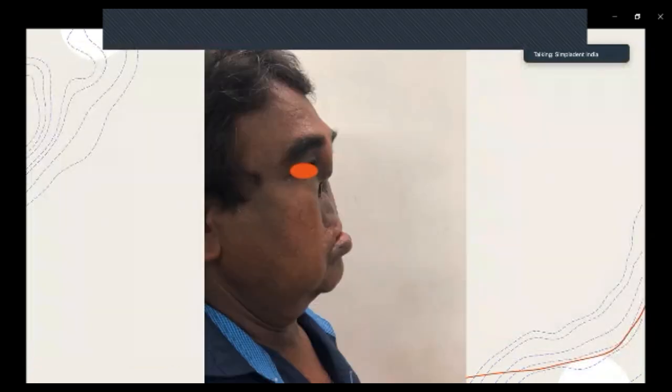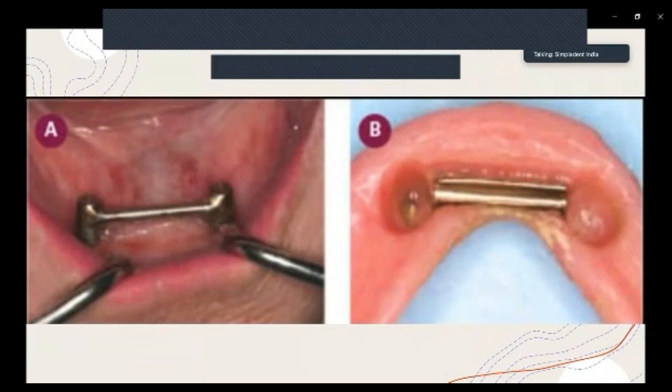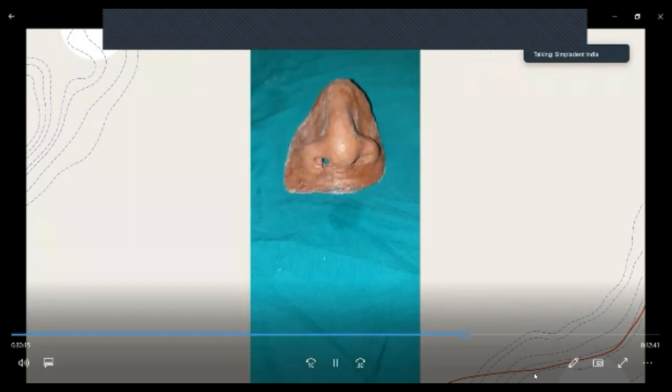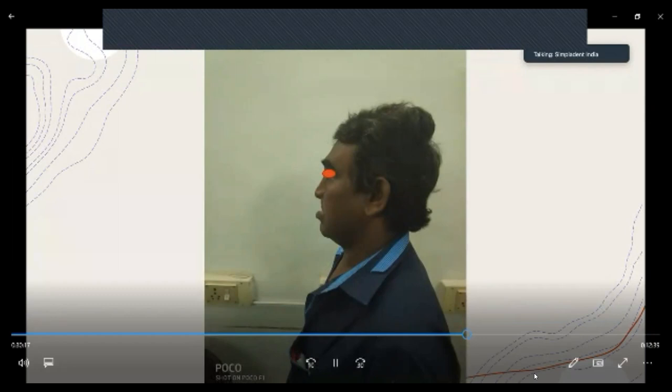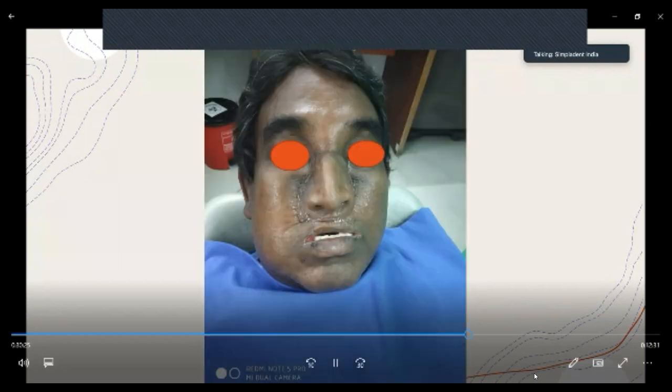So that was the cavity that was there. What we did was make a sleeve over the body of the implant, and then we cut it into two parts, and the nasal part has gone inside at the tissue part. So the clip has been formed, and such a simple solution we have created. As you see, our aim is to provide the simplest solution and to treat the patient least traumatically.